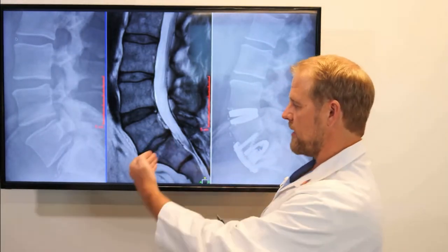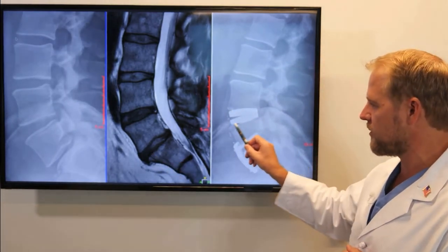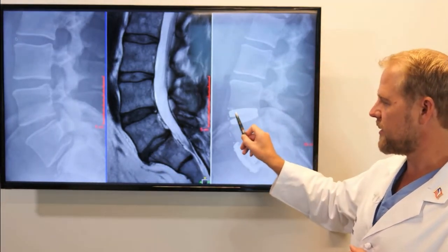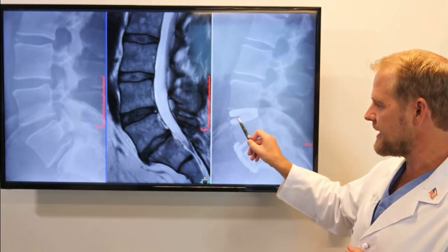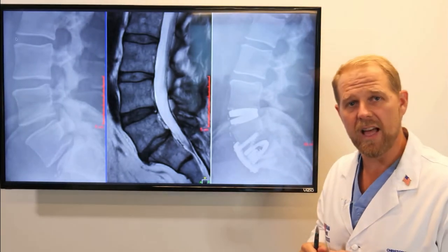This is done through a small incision below the belly button. We come into the front of the discs, and we can see here at L4-5 the disc has been removed and this is a disc replacement. We have metal on each side, plastic in between, and this allows movement to occur as the patient lives their life.